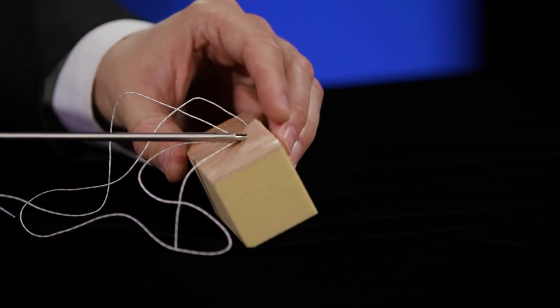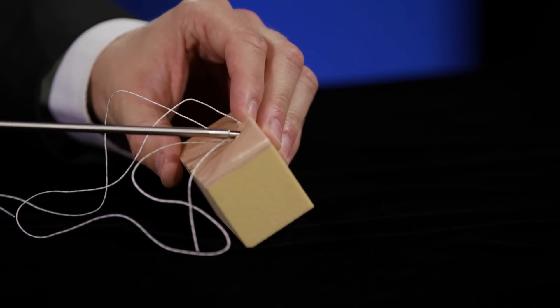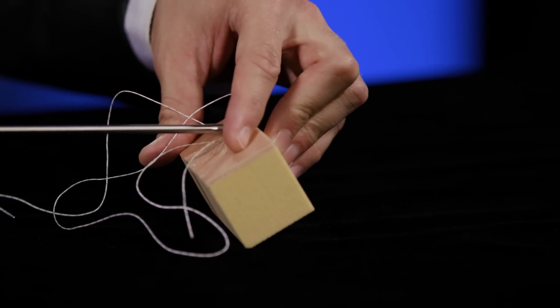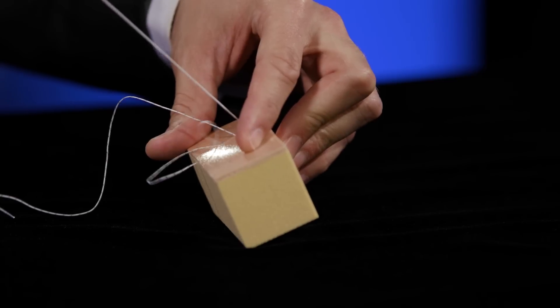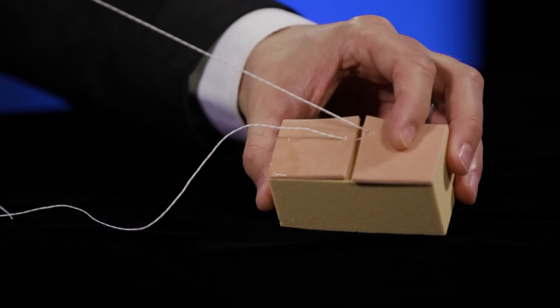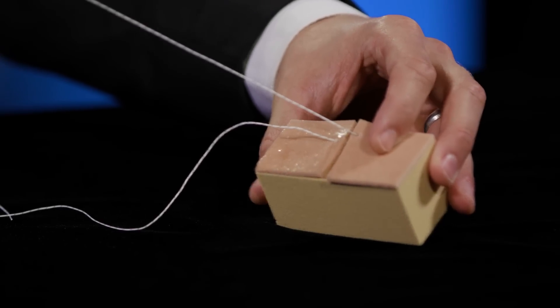Again you'll get a 4.5 millimeter bite. You'll compress with the front trigger and squeeze the back of your handle to push the needle through and underneath the tissue, which will capture the suture. You'll then pull that outside of your cannula and now you've got your inverted mattress stitch passed, which you'll then tie off for your capsular closure.